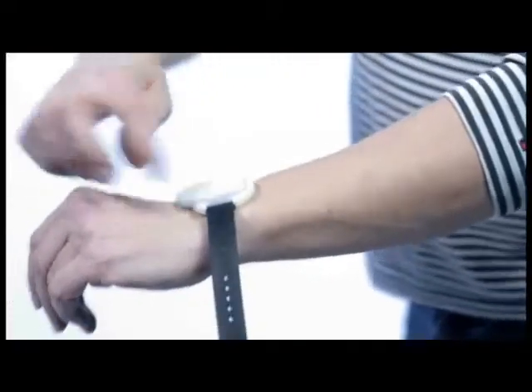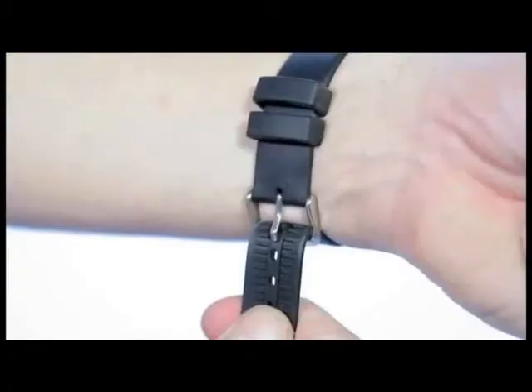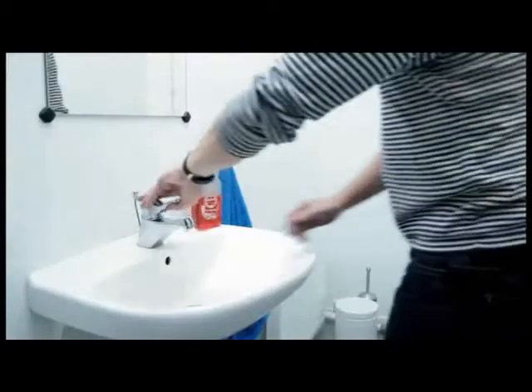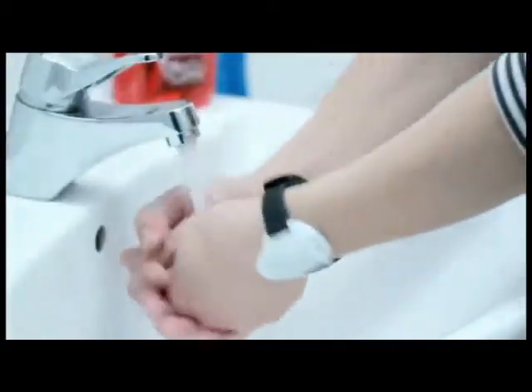It does not matter whether the sensor points forward or backward, and it can be worn on the left or right wrist, but must not be too loose. The armband can be worn while washing hands, but should be removed before showering.